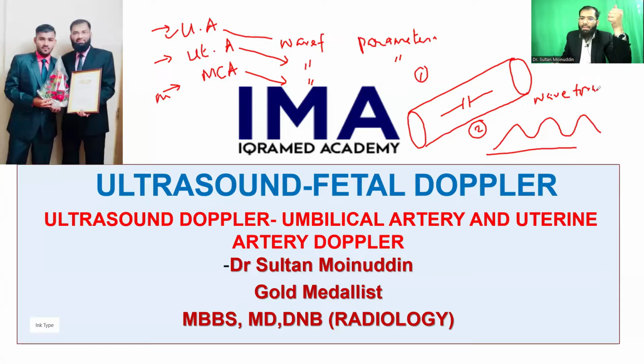Once you obtain the waveform, the third important thing is interpreting this waveform, that is what type of waves this is, and you calculate a few parameters out of this waveform based on the PSV and the EDV. I shall be discussing what PSV is, what EDV is, and based on this we calculate parameters like RI, PI, etc. I will also be telling you which of these are angle dependent and which are non-angle dependent. So don't be in a jargon, we'll be making everything very simple.